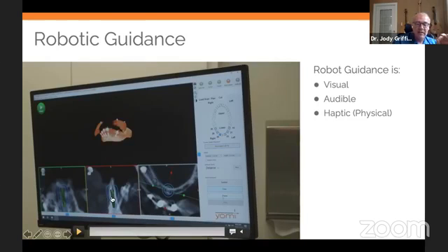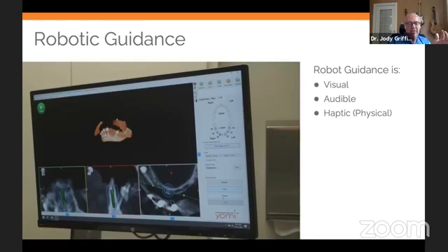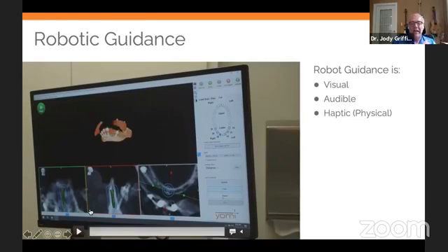The nice thing about this is I cannot get off of long axis from that implant, whereas in some of the other navigational systems, it's master slave. So yes, you're seeing it on the screen, but it's not being controlled in any manner. If you get off long axis or put it in the wrong position, you can do that. With this being haptic and physical, you cannot deviate from your plan, which means you've got to plan it correctly, which we spoke about earlier.